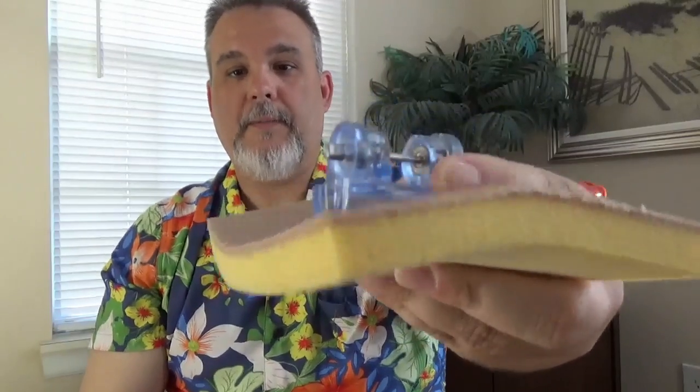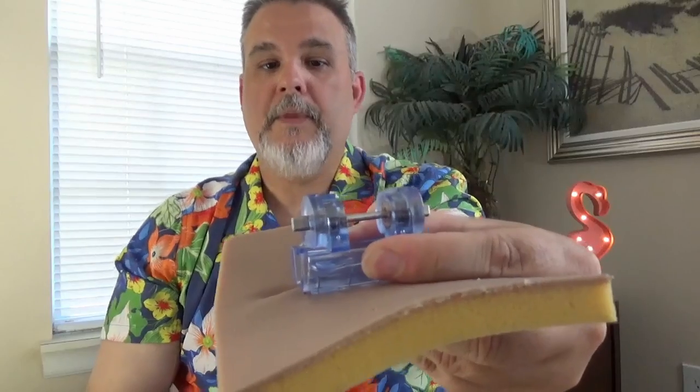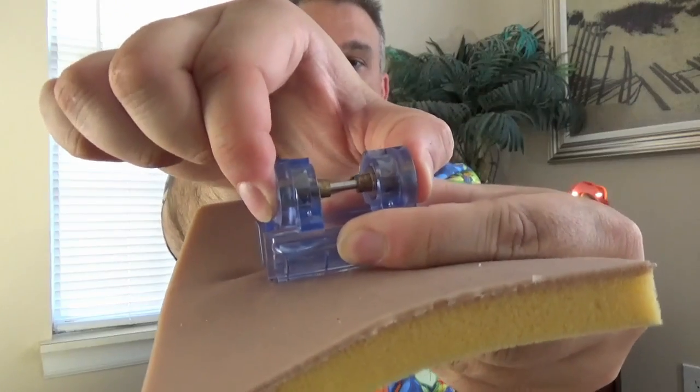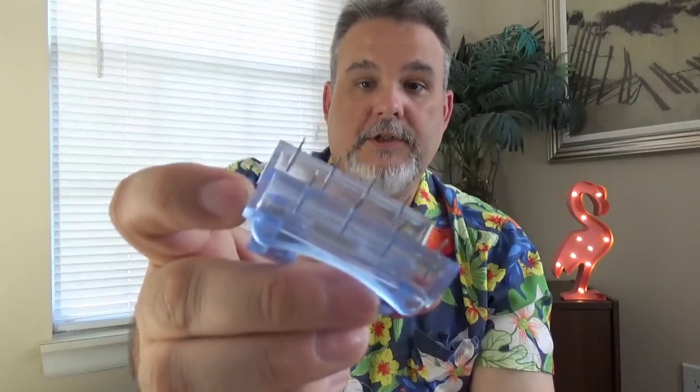To take this off, it's very simple. Grab the clamp to stabilize it and make sure it doesn't slip. Give a little bit of pressure, squeeze the two ends together, and the clamp comes right open.